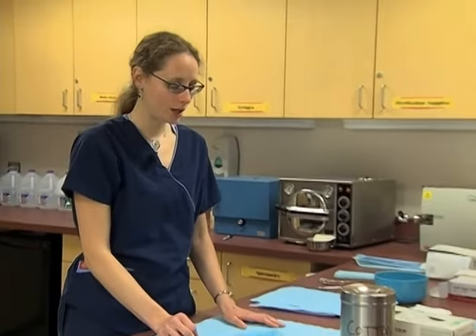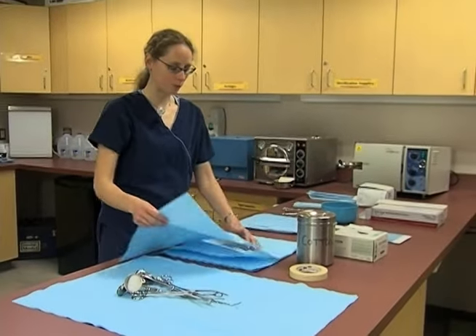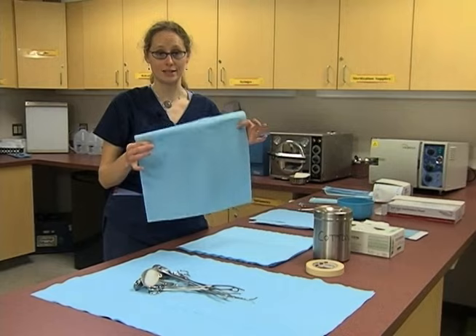So once we have our surgical tools ready, the other supplies that we're going to need is autoclave paper. And a lot of times it's just this blue paper. Sometimes people refer to it as CSR.